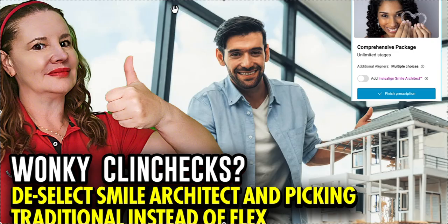So I think it's just a matter of, I personally like personal preferences better. Taking the time, one or two hours, to dictate your personal preferences, which is something that we will do with you if you are a concierge member. We will take the time to go through your personal preferences with you, but not in the first month or two. We've got to get to know you first, to get to know how you practice before we can tell you how to program that, because you're not us and I'm not you. So I don't know how you like to do things. So it's something that we can definitely do in time.